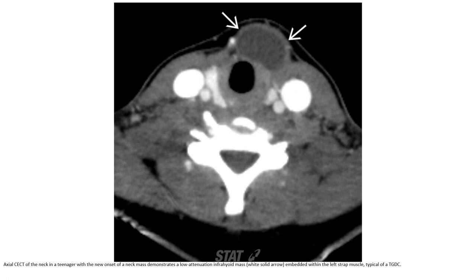Contrast CT of the neck in the same patient with the new onset neck mass demonstrates a low attenuation infrahyoid mass embedded within the left strap muscle, consistent with a thyroglossal duct cyst.